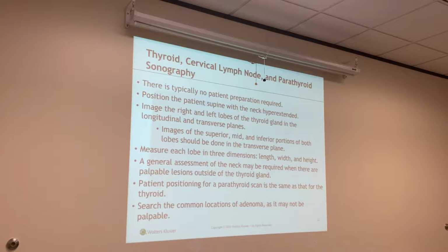Studied on kidney, same thing for the thyroid. Okay? When we measure something, you've got to make sure you see it in 2 planes. Do not measure it if it disappears. It's not real. Okay? Because sonographers, we can make pathology, we can miss pathology. Okay?